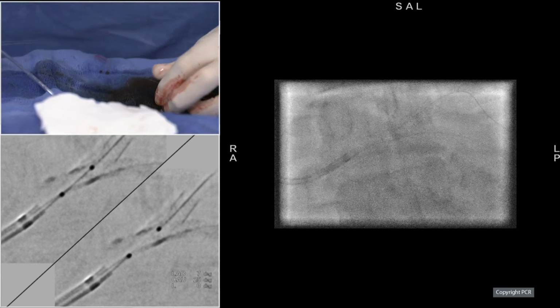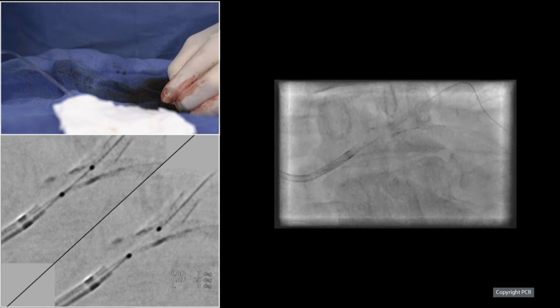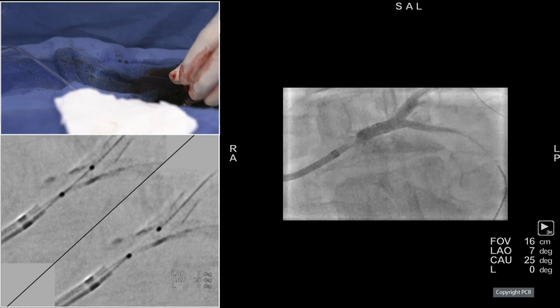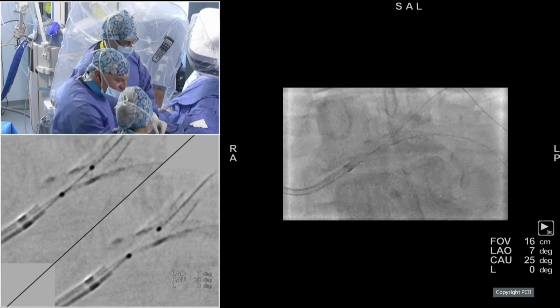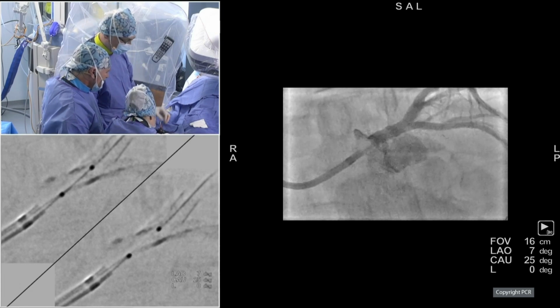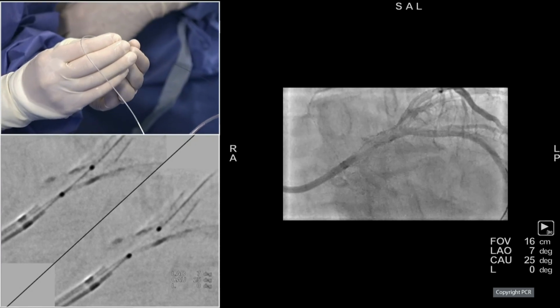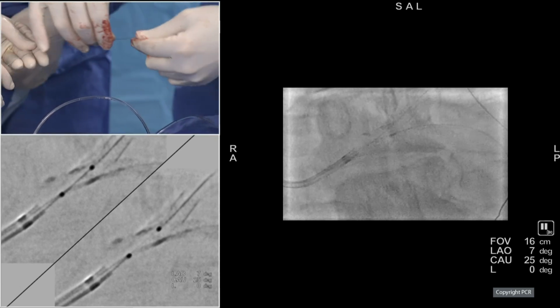So what you can do is the control angio now. Okay, so now maybe we have time to do the OCT. Not bad. I like it, do a run of OCT. You could record the run of the OCT. During this time we have a discussion with Praveen, and we will come back to you. In 5 to 6 minutes. Is it okay? Perfect. That's good news.